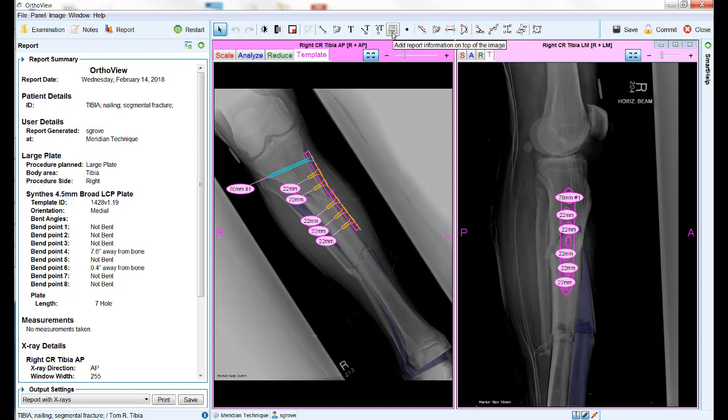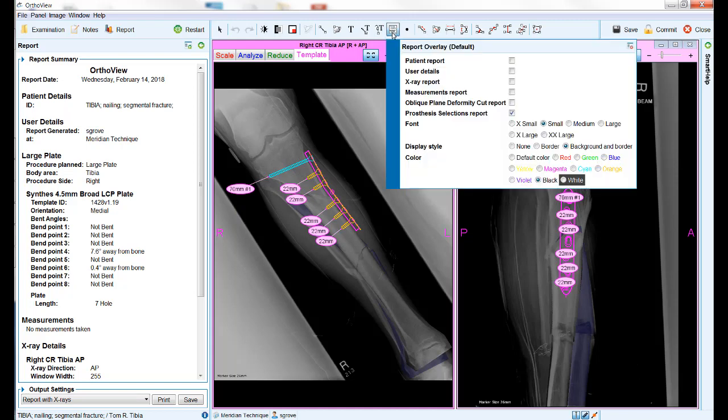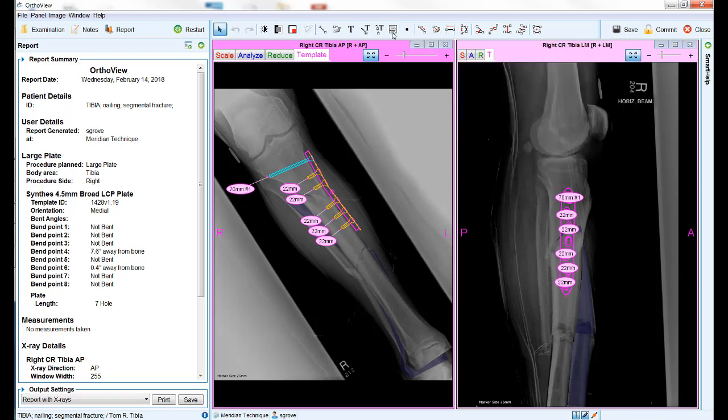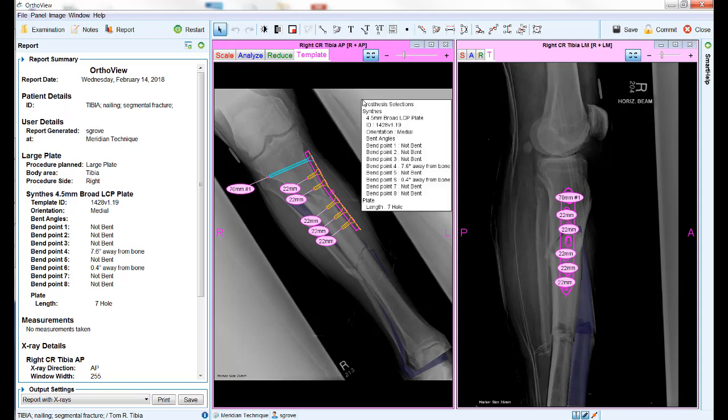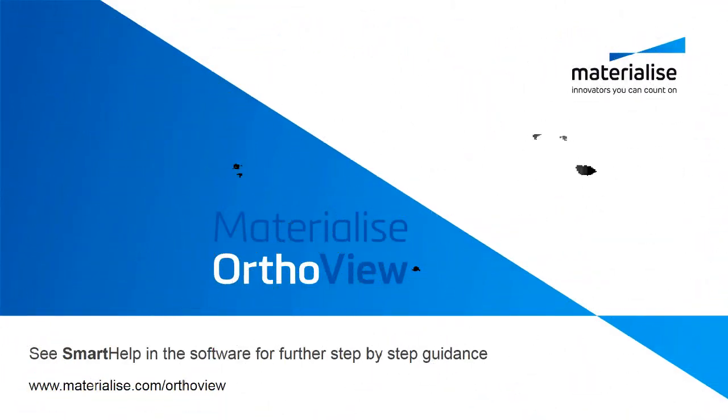Before using this option for the first time, right click the icon to set your preferences. Then left click the icon and left click anywhere on the screen to insert the report information into the image. For additional hints and tips relating to every stage of the planning process, use the smart help tab located on the right hand side of the screen when using the software.